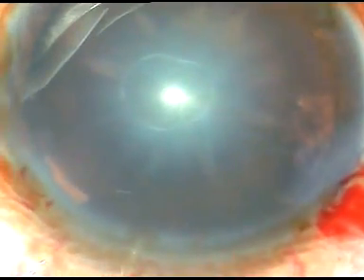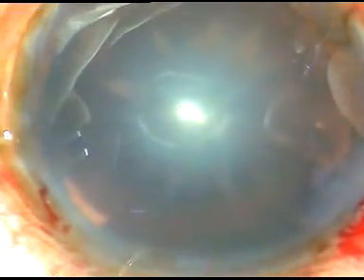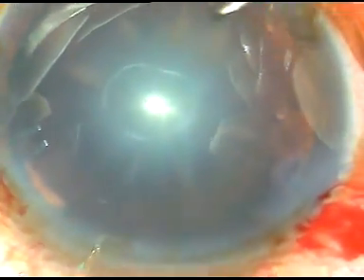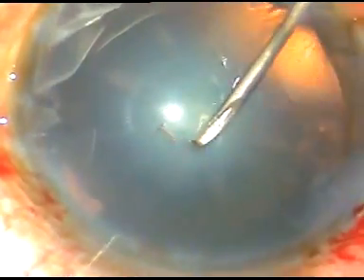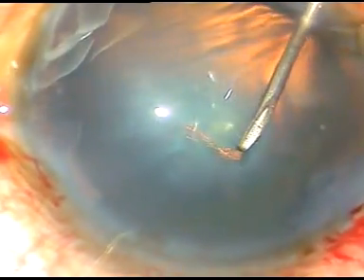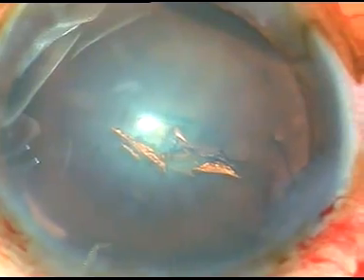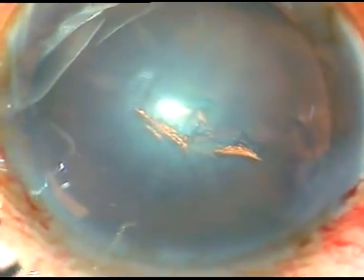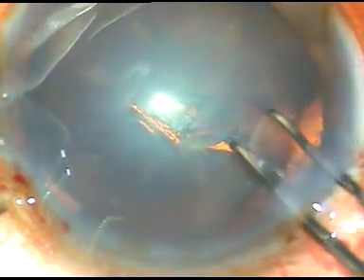Now the anterior capsule is going to be incised with a 26 gauge bent cystitome. Let us see what happens. As I incise the capsule, you can see that the whole lens moves and there is wrinkling or there are waves on the anterior capsular rim which indicates a weak zonule.